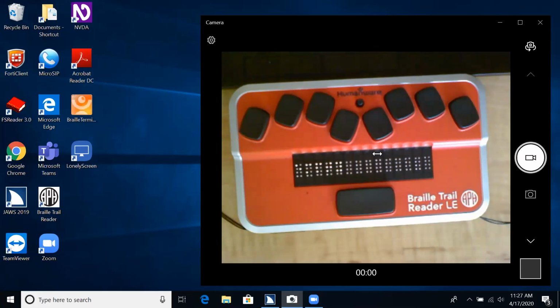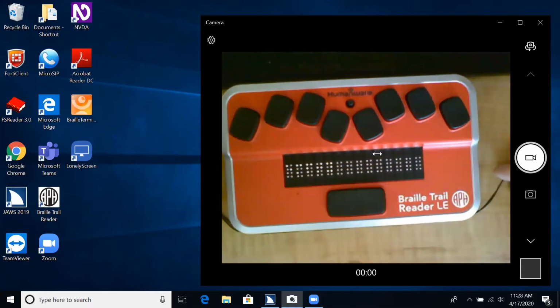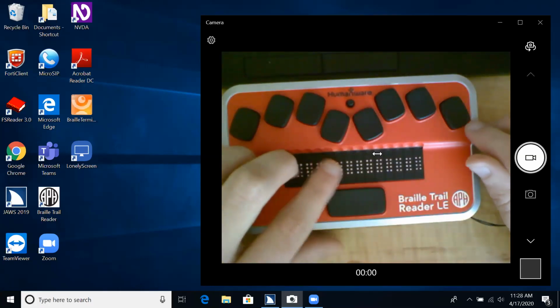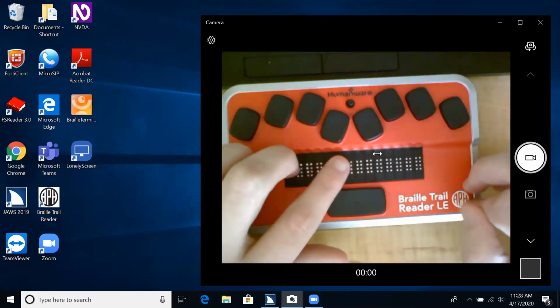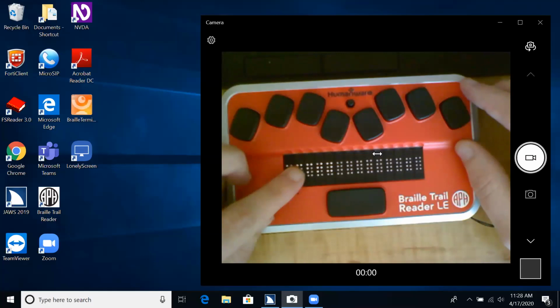So again, it is very basic in terms of what we're able to do with the notes side of things, but it's a great introductory tool or even a secondary tool when we start looking at utilizing refreshable Braille displays and how we use refreshable Braille technology, right? I'm in a meeting, I'm in class, or I need to take down quick notes for some task and refer to those later. This is going to be a great way to do that, as well as introducing some of that cursor placement concept, the editing, and leading to proofreading and getting comfortable with cursor manipulation, which can be very difficult to teach.